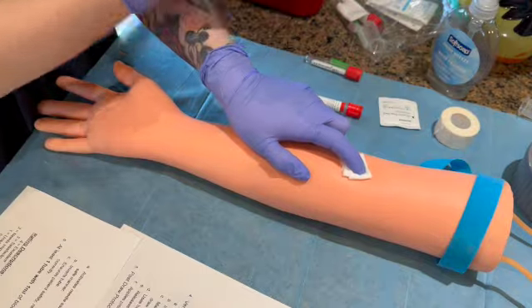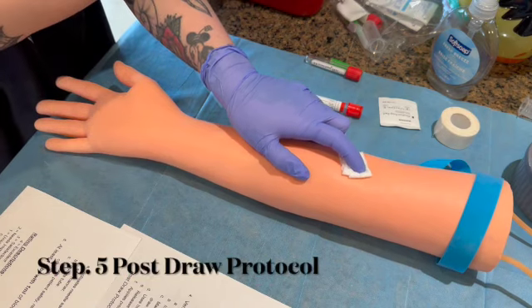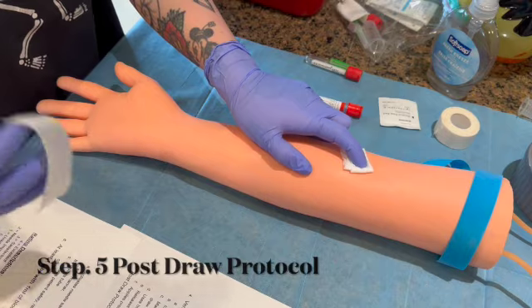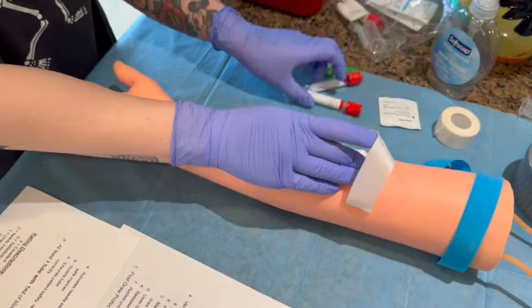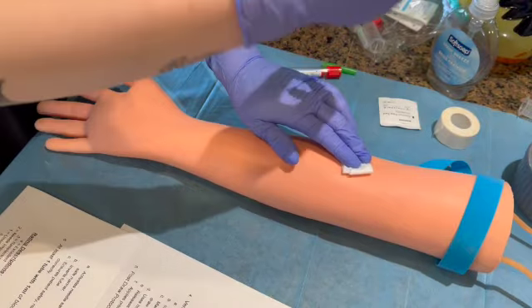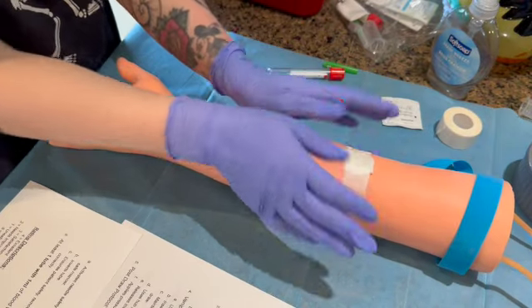And our next step is we're going to be into step 5, the post-draw protocol. So we obviously activated the needle safety and disposed of it in the sharps container. Our tubes were inverted during the venipuncture process. So if you have not done that, this would be a wonderful time to grab it and remember to invert. And then we are going to check our site, make sure Mr. Thornton here has stopped bleeding, and we're going to apply our bandage.